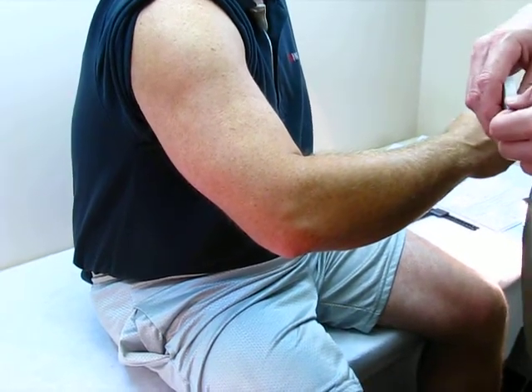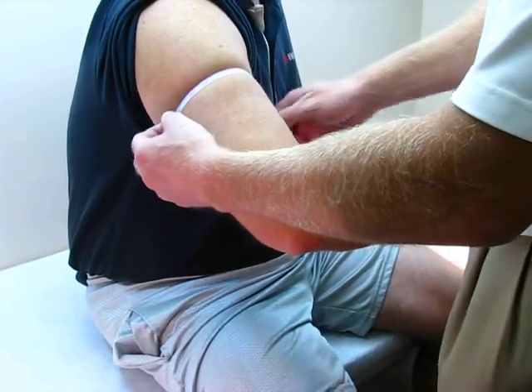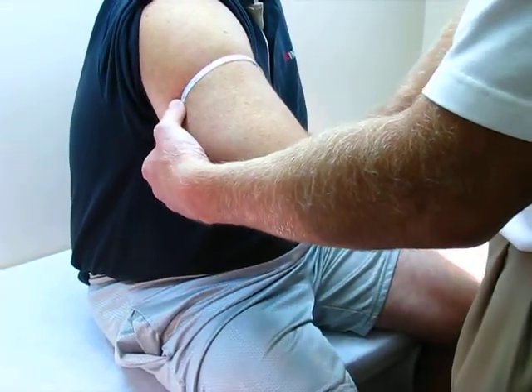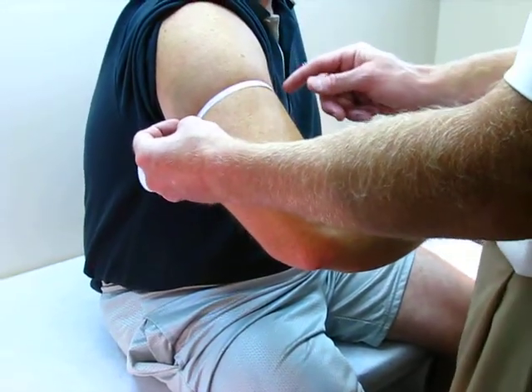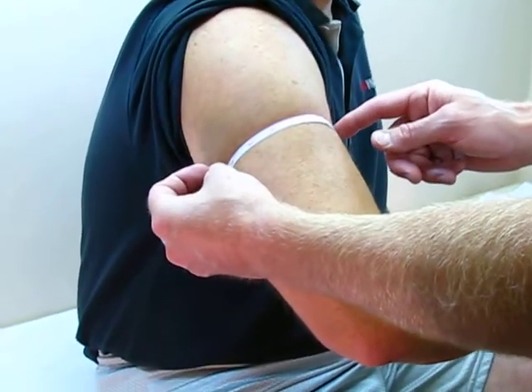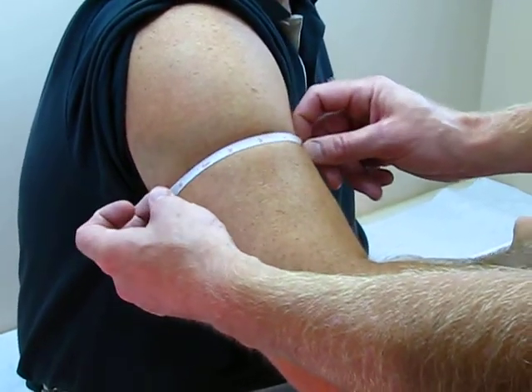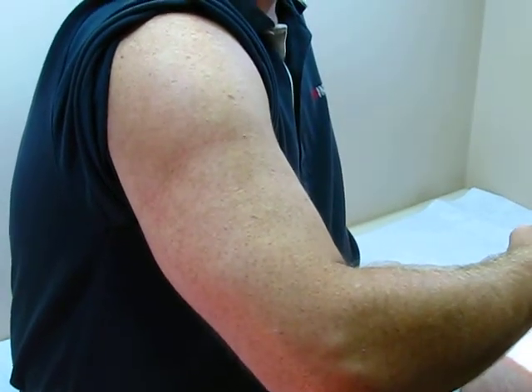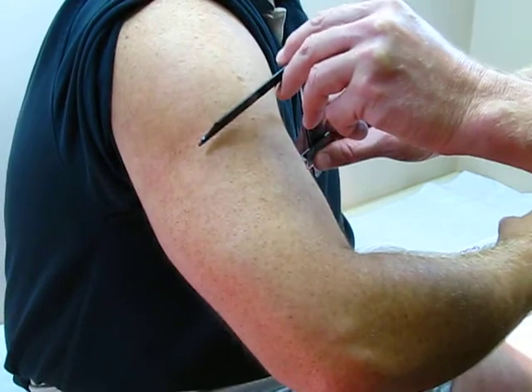For our first measurement, measure A, we're going to take a circumference on the humerus at the level of where you want the height of your frame to be. Once we have that circumference, at that same level, we're going to take a medial lateral measurement.